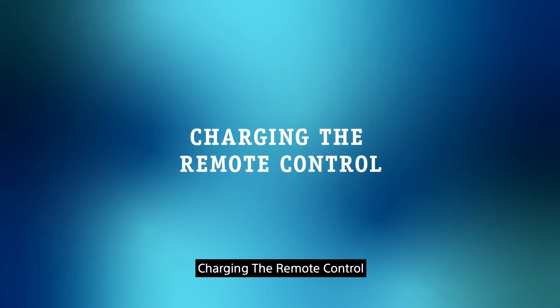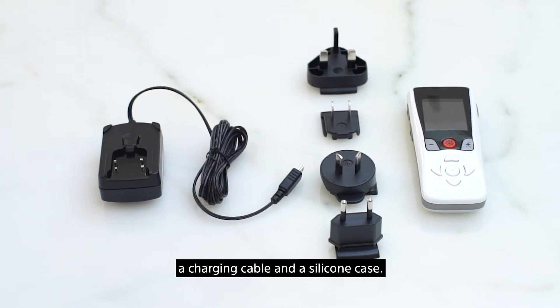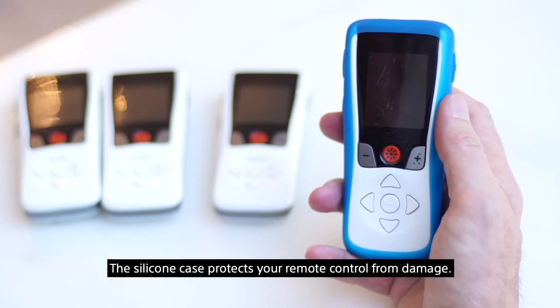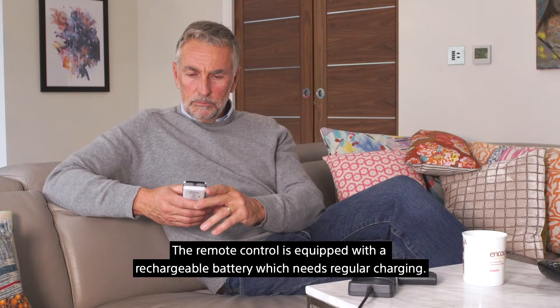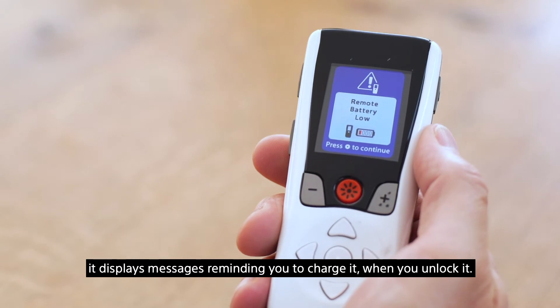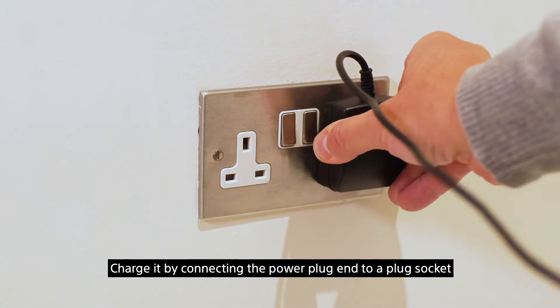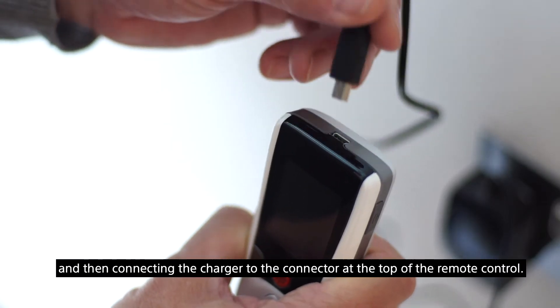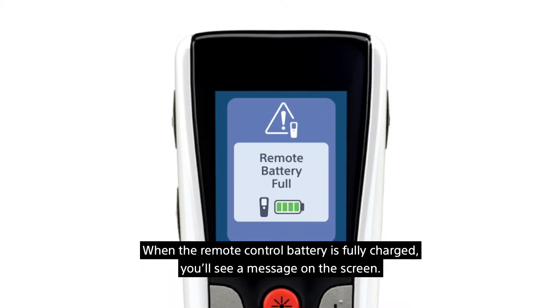Your remote control kit includes the remote control, a charging cable, and a silicone case. The silicone case protects your remote control from damage. The remote control is equipped with a rechargeable battery which needs regular charging. When the remote control is low on battery, it displays messages reminding you to charge it when you unlock it. Charge it by connecting the power plug into a plug socket and then connecting the charger to the connector at the top of the remote control. When the remote control battery is fully charged, you'll see a message on the screen.